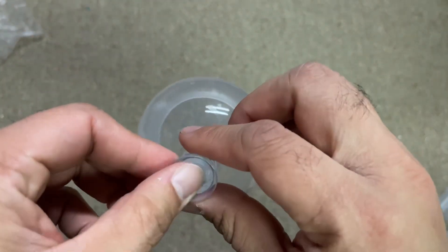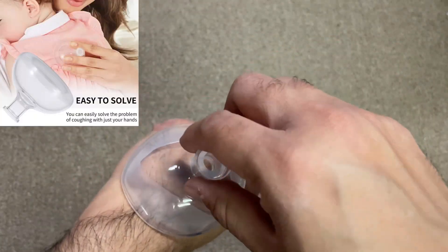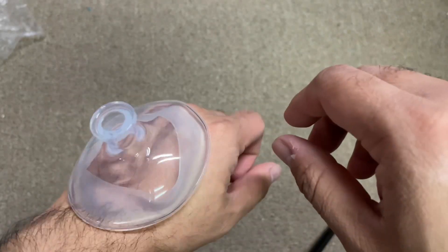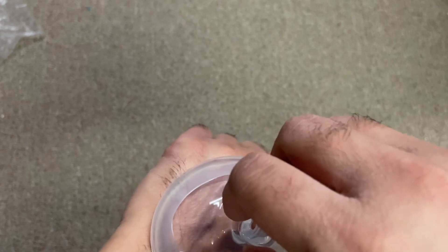This will create a suction to break up the mucus. You can see the suction itself is very strong — you just put it here and it will suction and help in breaking up the mucus.